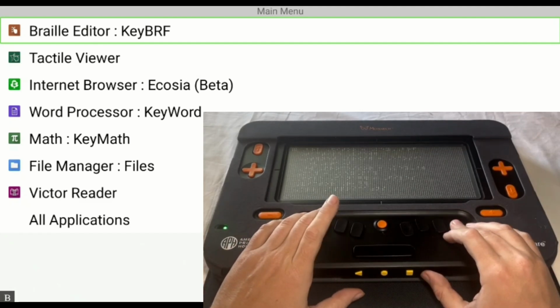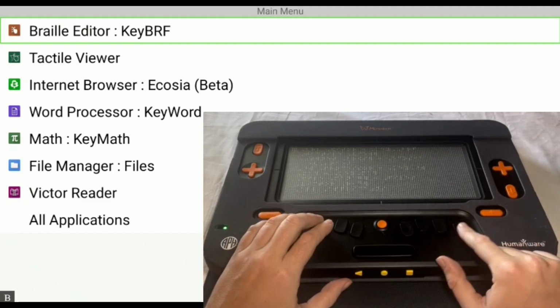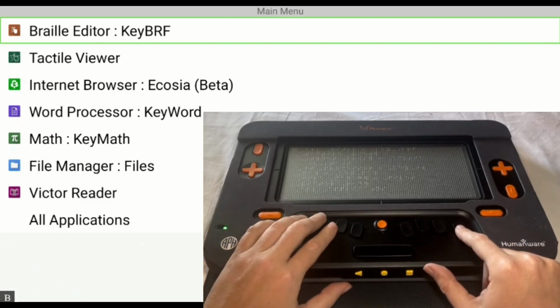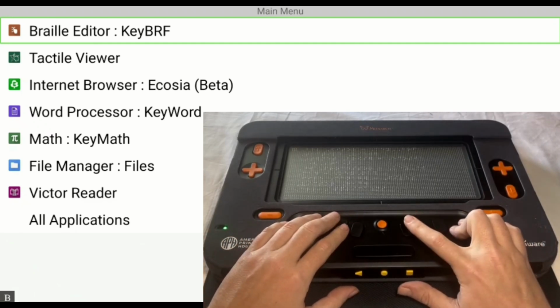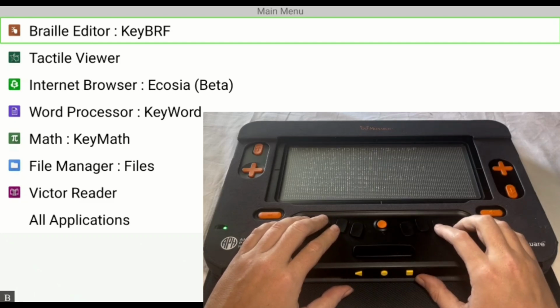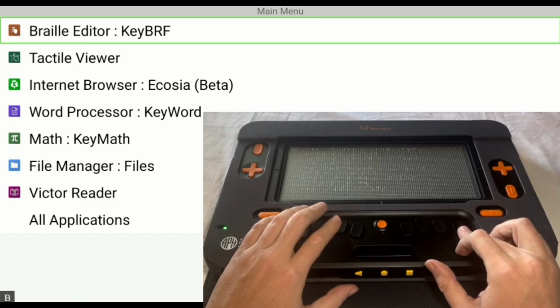If I hold Enter and .1 down. Softer. Softer. Softer. And I'm holding the Enter key down and just tapping .1. Accessibility volume set to 80%. Softer. It's going down. Louder. Louder. Louder. Accessibility volume set to 90%.